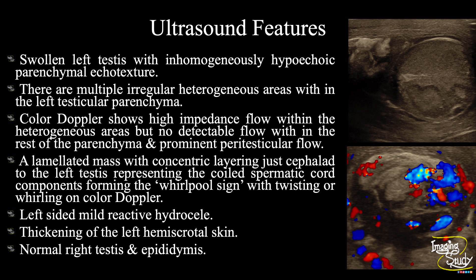In summary: a swollen left testis with inhomogeneously hypoechoic parenchyma is seen, with multiple irregular heterogeneous areas within. Color Doppler shows high impedance flow within the heterogeneous areas but no detectable flow within the rest of the parenchyma, and prominent peritesticular flow. A lamellated mass with concentric layering just cephalad to the left testis represents the coiled spermatic cord components forming the whirlpool sign with twisting on color Doppler. There is also left-sided mild reactionary hydrocele and thickening of the left hemiscrotal skin. The right testis and epididymis show normal sonographic features. These features conclude this as a case of left-sided late sub-acute testicular torsion.